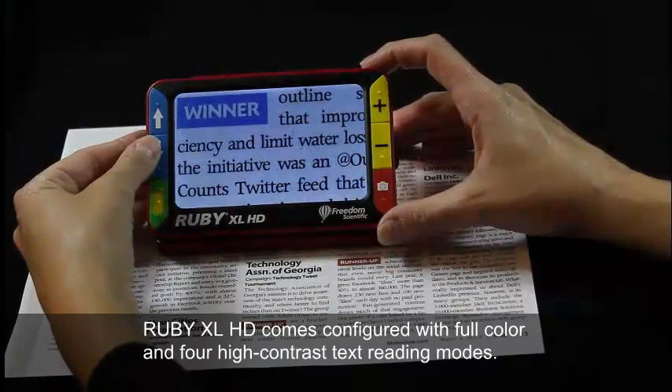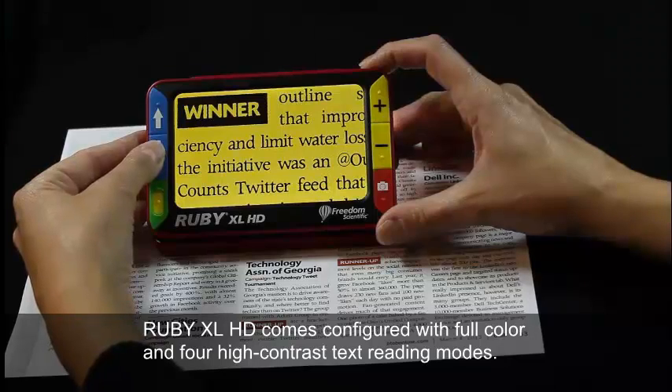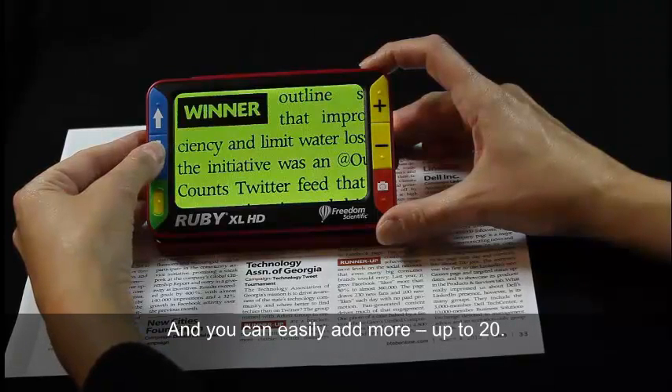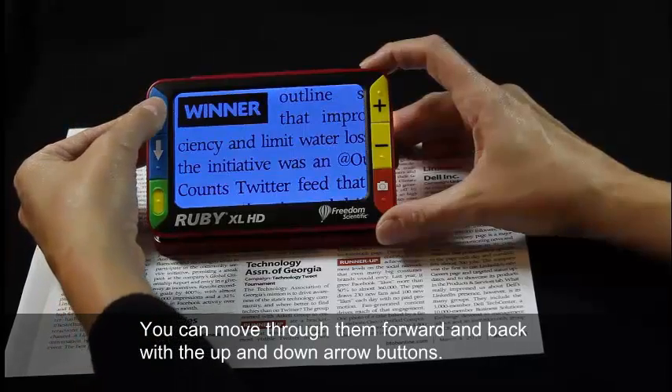Ruby XL HD comes configured with full color and 4 high contrast text reading modes. You can easily add more, up to 20. You can move through them forward and back with the up and down arrow buttons.